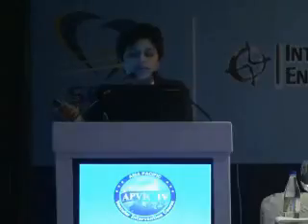The purpose is to discuss knobology, that is, what probe to use, what button to press in order to obtain good images. Probes are generally described by size and shape of their face. Mainly in doing vascular duplex scan, we are using two probes. One is the linear probe, which is a high frequency probe, frequency varying between 5 to 13 megahertz, and a phased array probe, that is the cardiac probe, which generates electronically steered beam in a closed array, and the frequency is low, that is 2 to 5 megahertz.